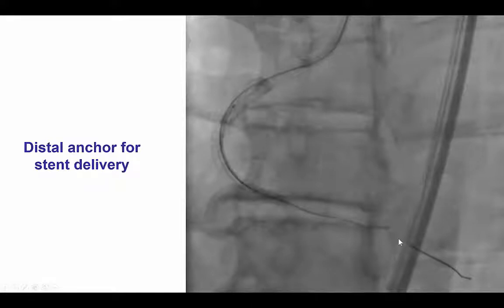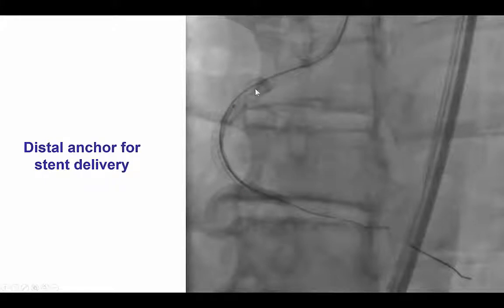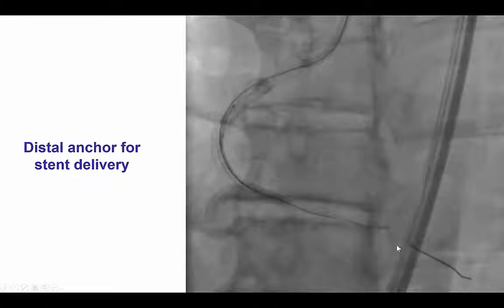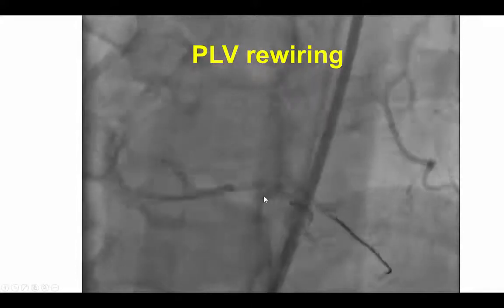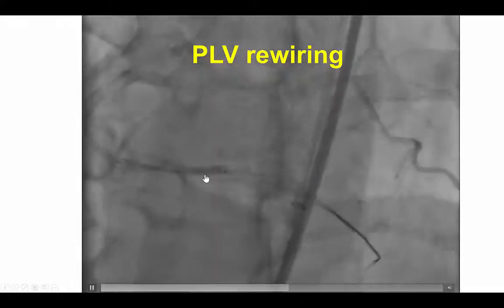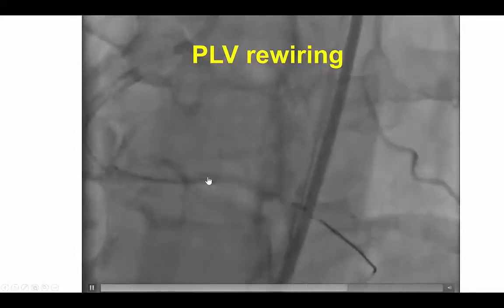We switched the wire for a workhorse wire, but then had significant difficulty delivering any stents distally because of tortuosity and the presence of the previous stent. Therefore, we advanced a second guidewire and over it inflated a balloon to perform the distal anchoring technique. That balloon fixed the wire in the true lumen, and over this we were able to deliver the stents. The stent was now positioned at the distal cap into the distal vessel.